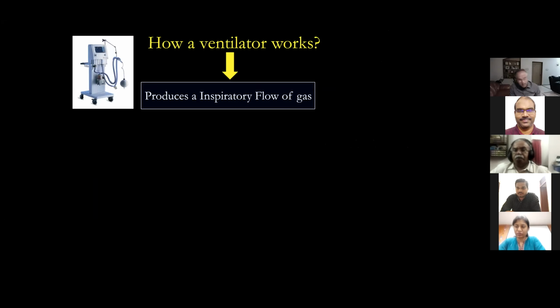Okay. So what does a ventilator do? I have done this in the first class. A ventilator just produces an inspiratory flow of gas, isn't it? That's what it does. It doesn't do anything other than that. A ventilator produces the inspiratory flow of gas.